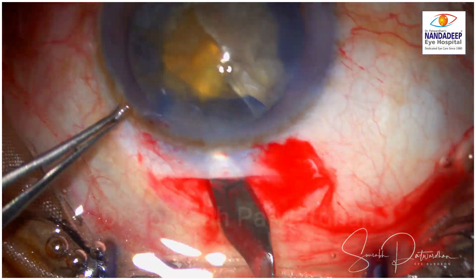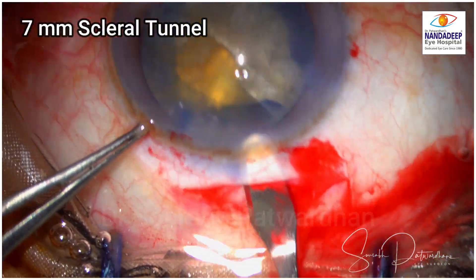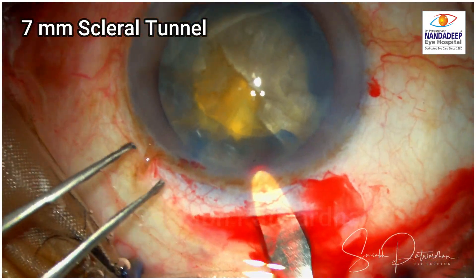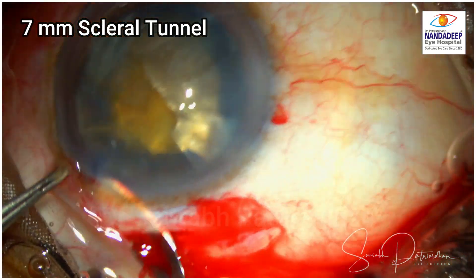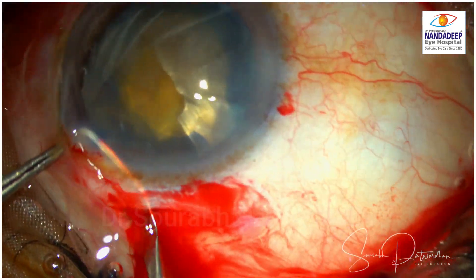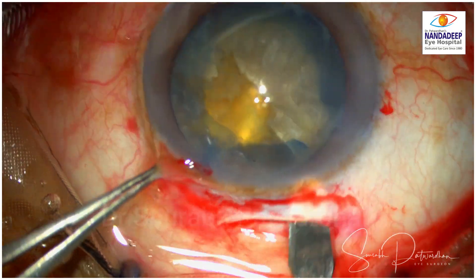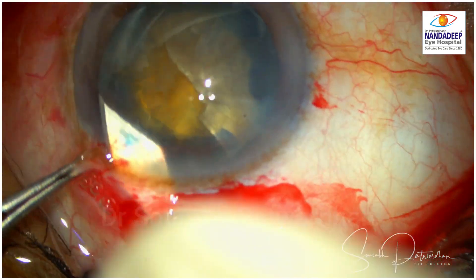Now I am going to prepare a scleral tunnel which is around 1.5 to 2 mm away from the limbus and the length has to be 7 mm. It has to be a good size scleral tunnel because I am going to remove this big nucleus from the bag where the posterior capsule is already dehiscent, so I don't want any resistance while removal of the nucleus.